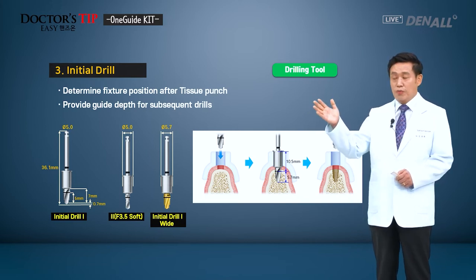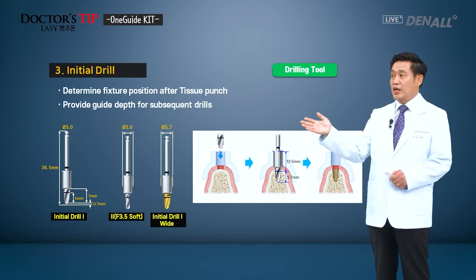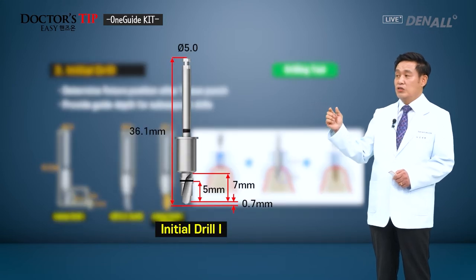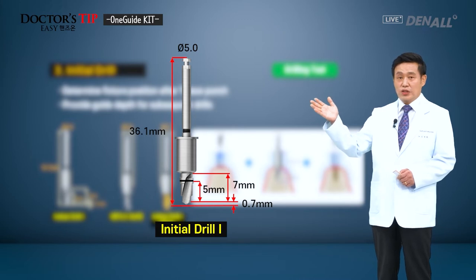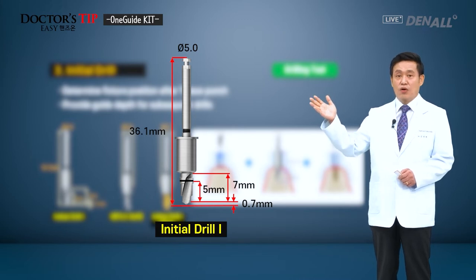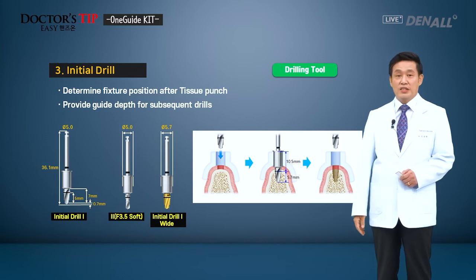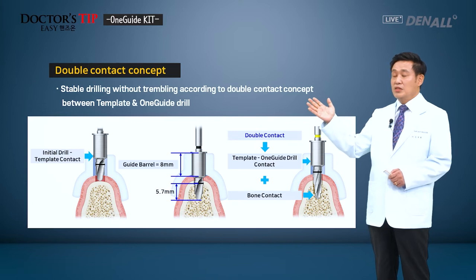Next is initial drill. After you do tissue punch, you accurately define fixture position using this. The length of the drill is 5 mm. You use the short drill to mark the position of the fixture. Using this short initial drill, you can get the double contact concept.